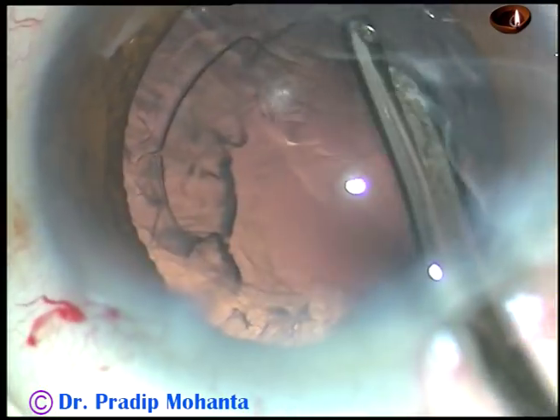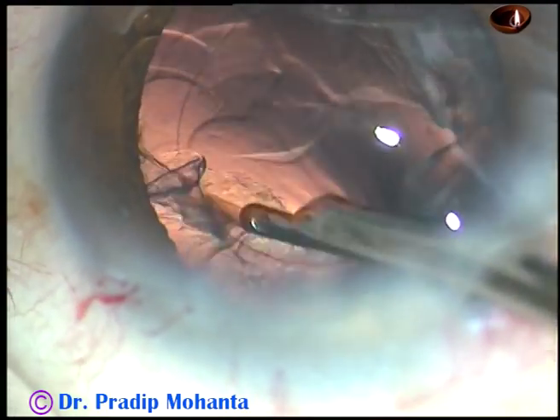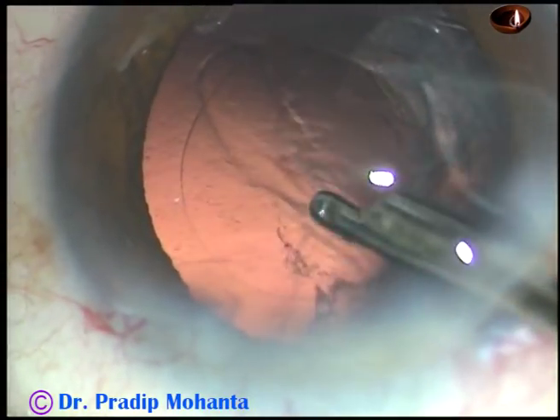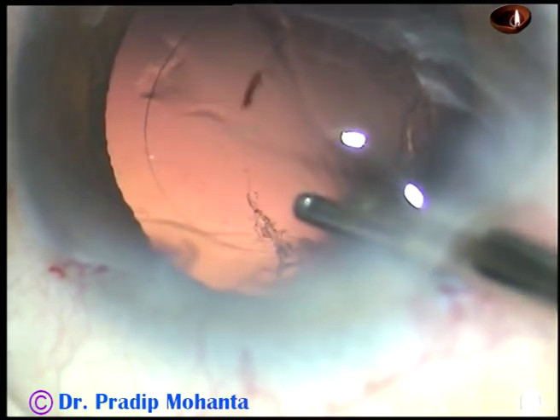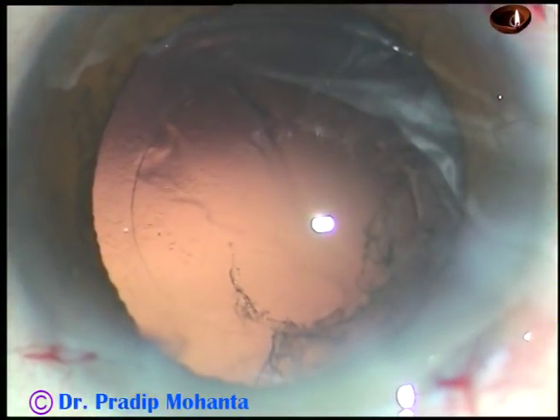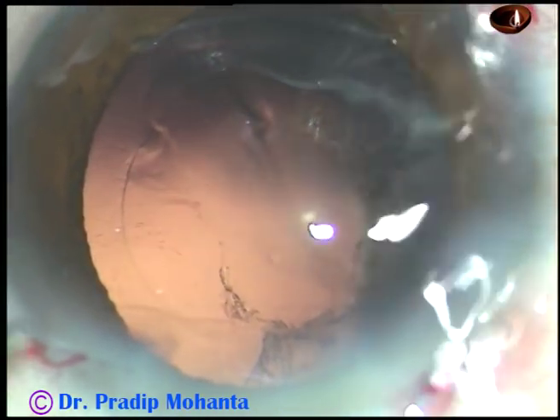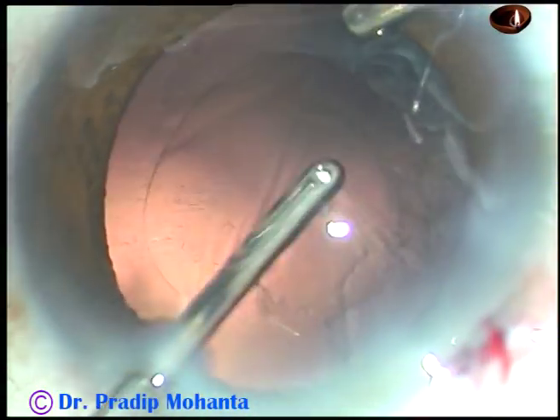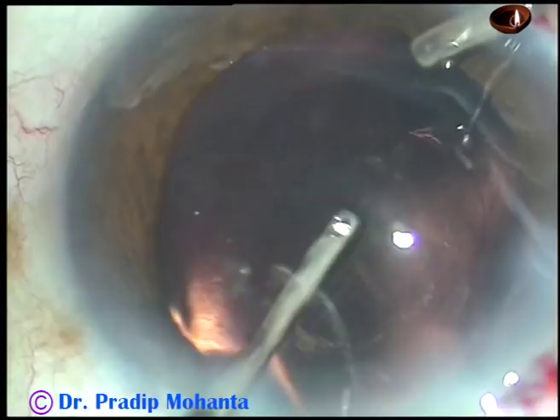The cortical matter from 3 o'clock to 8 o'clock is being removed by the Simcoe cannula. Most of the cortical matter from 1 o'clock to 8 o'clock has been removed. Since the side ports are very small in this case, I am going to use bimanual irrigation aspiration through the side ports to remove the cortex from the sub-incisional area. The cortex from the sub-incisional area has been removed.